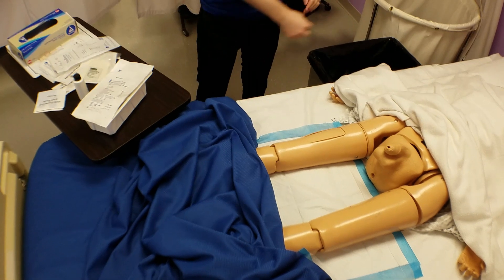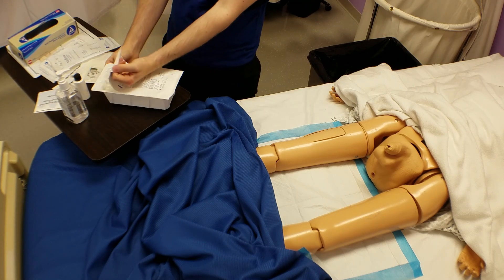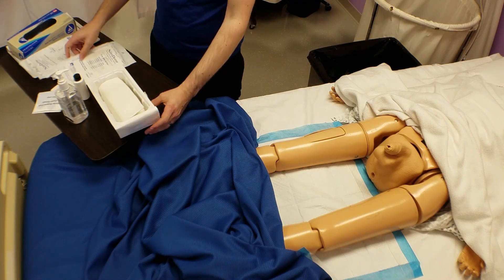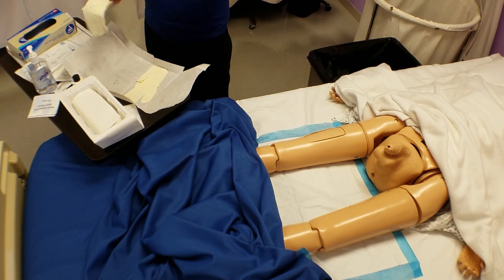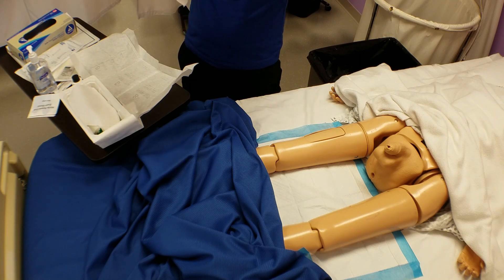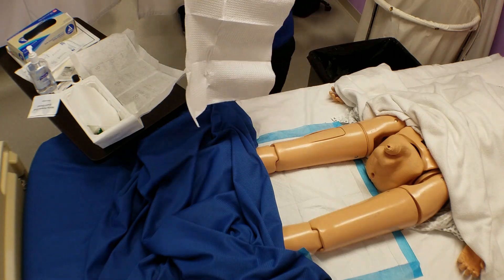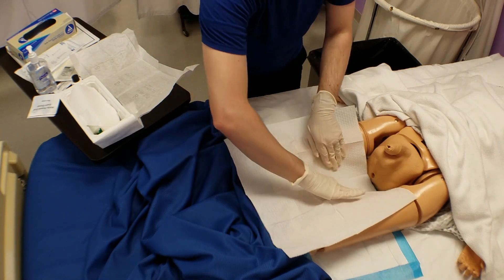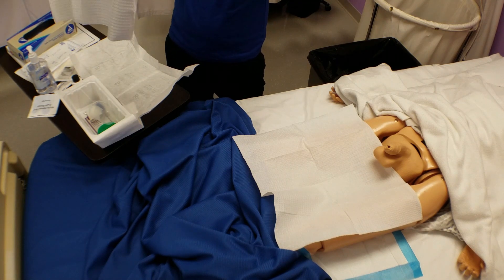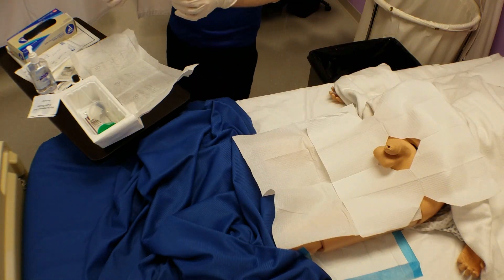Remove your gloves and wash your hands. With clean hands, open the straight catheter kit towards you or toward the side, ensuring you do not cross over the exposed contents with your arms. Using aseptic technique, place the sterile square drape under the penis. You may apply sterile gloves first and place the drape without the gloves touching the patient or bedding, or grab the drape by its edges with clean hands. If you haven't applied sterile gloves, do so before grabbing the fenestrated drape. Place the drape so that the center hole exposes the penis. You should now organize the equipment in your tray.